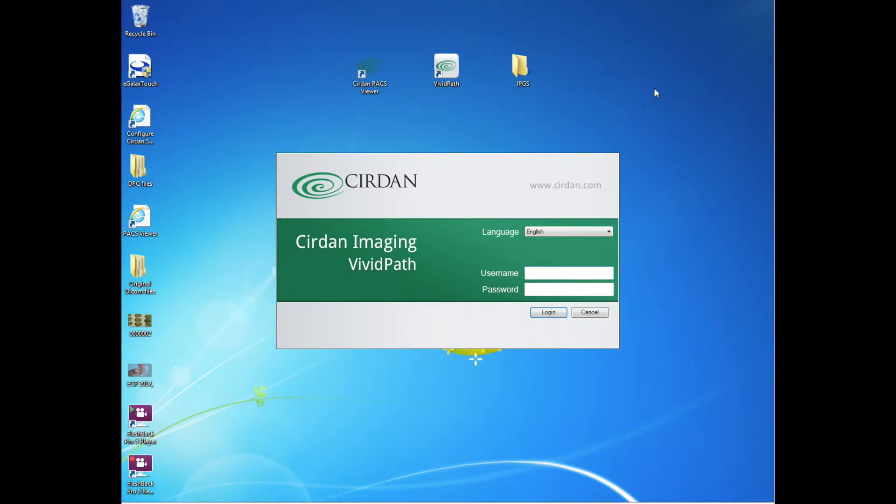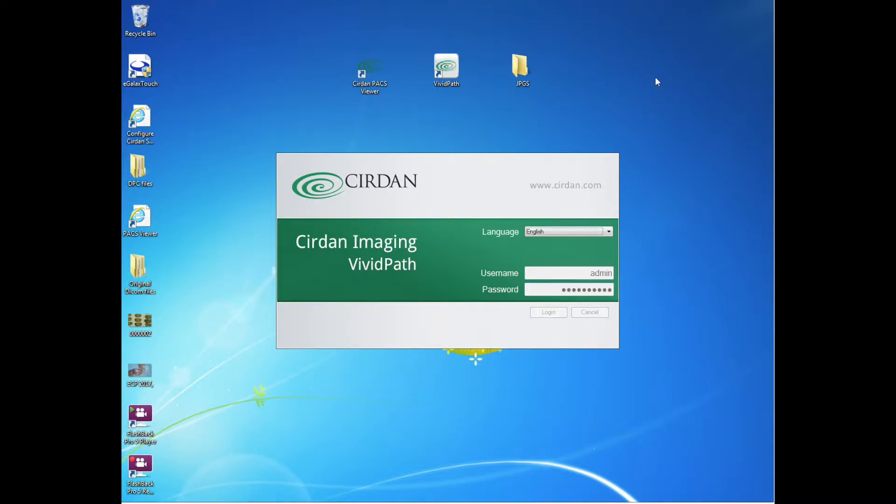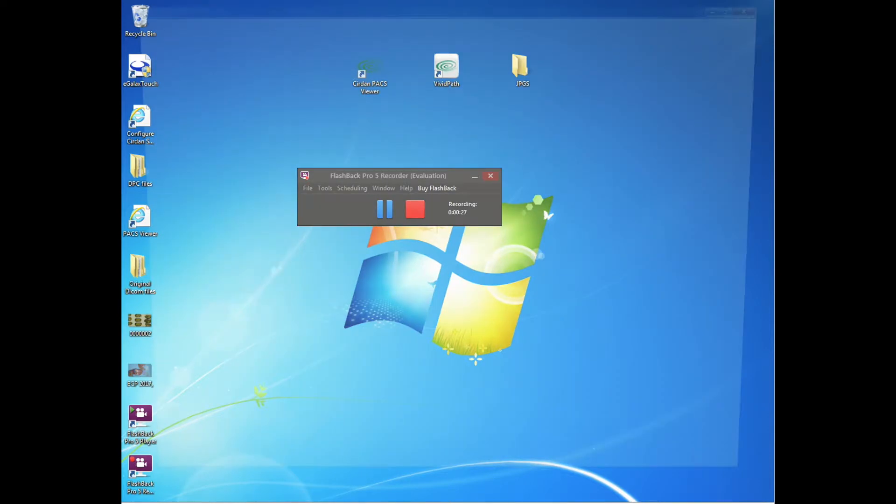Okay, here we're going to start a case using the Sirdan's PathLight gross imaging camera. I'm opening the VividPath software, I put in my username and my password, it opens up the software.